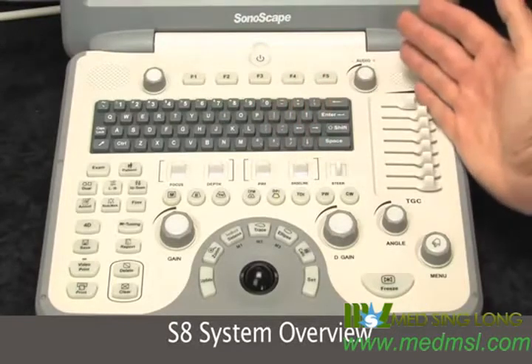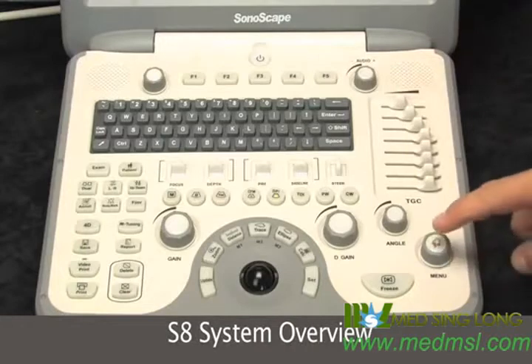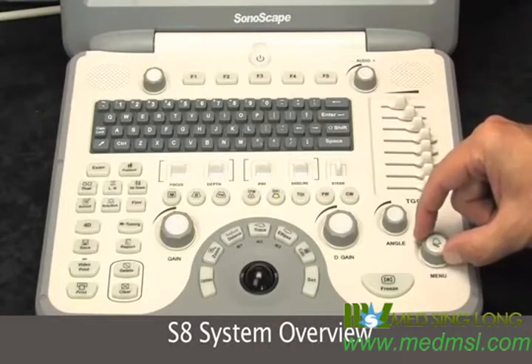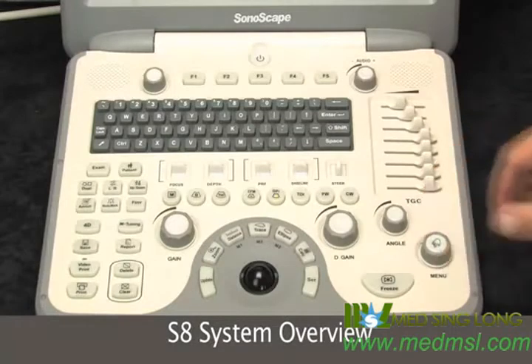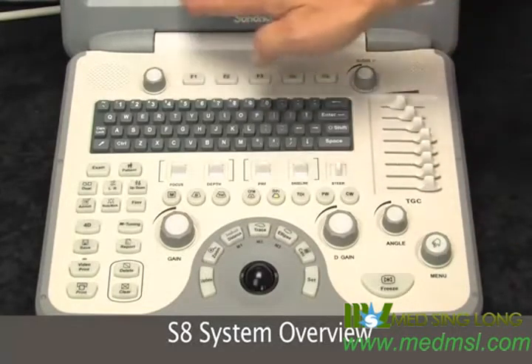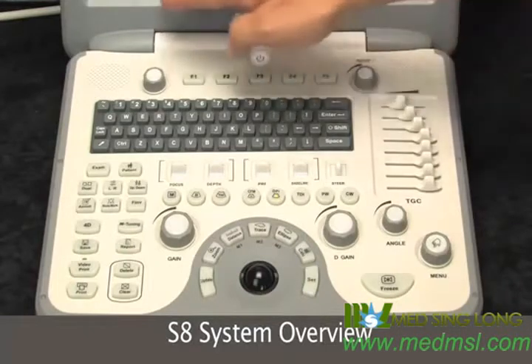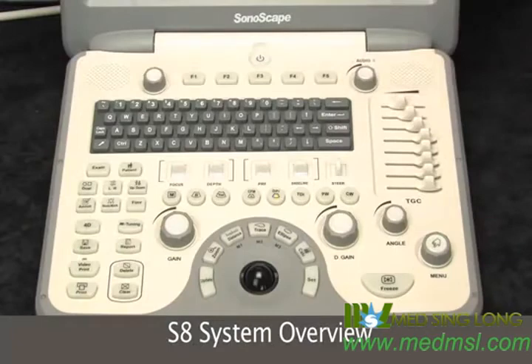Over on the right we have the TGCs and your freeze button. There's also a menu key that's dual function — you can press the menu button to select what you have scrolled to with the dial. Soft keys on the top will be associated with keys that change depending on what mode you're in on the bottom of the screen, and some can be configurable.